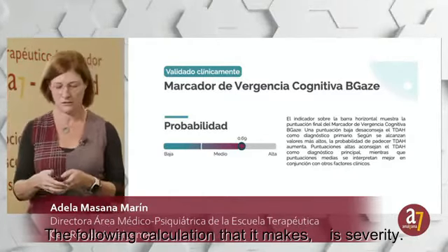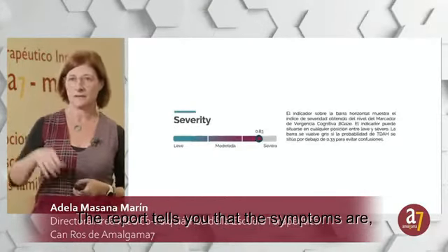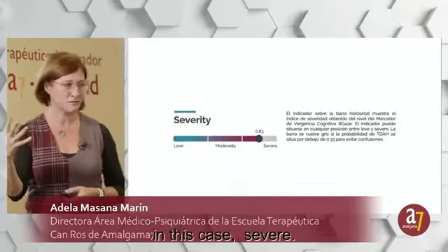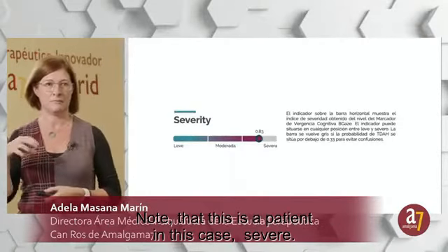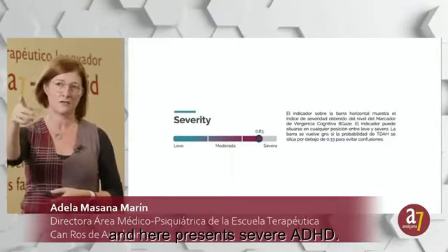The following calculation that it makes is severity. The report tells you that the symptoms are, in this case, severe. Note that this is a patient who never had been diagnosed before, and here presents severe ADHD.